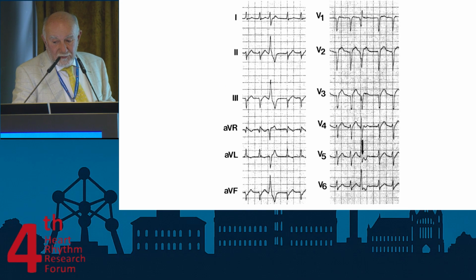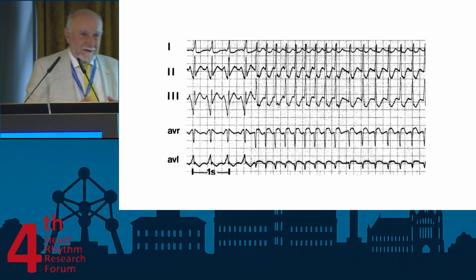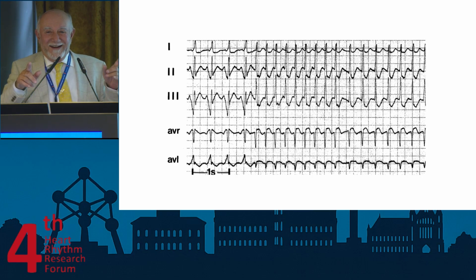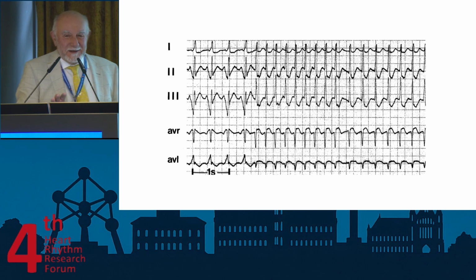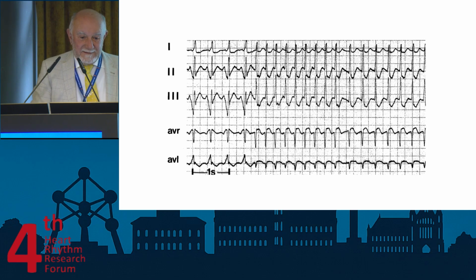Okay, well then we'll go to the next one. Ali, how many people do we have still? We said that the previous one was skipped, because otherwise we need a winner. So there are some people still alive. Andrea was alive. Jean-Baptiste. Okay. Let's see. Maybe this will be the one giving the winner.